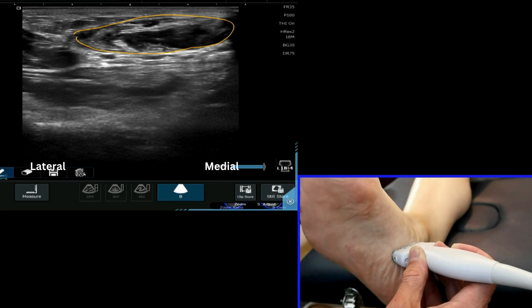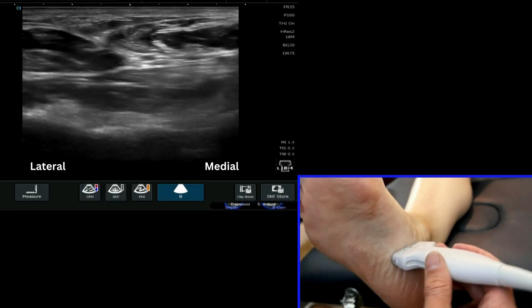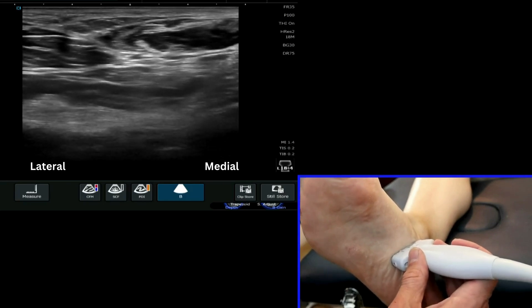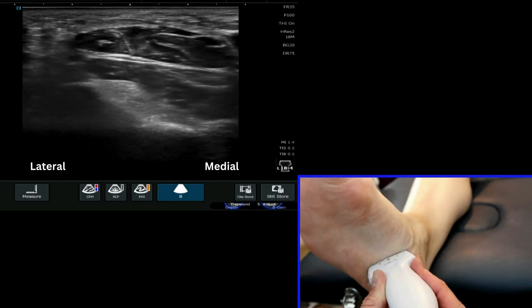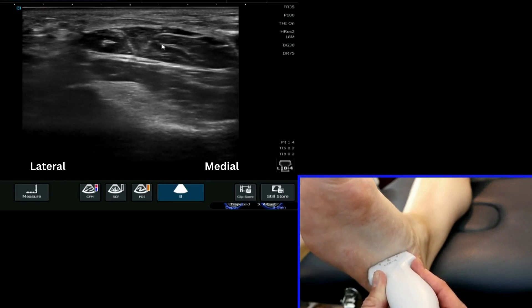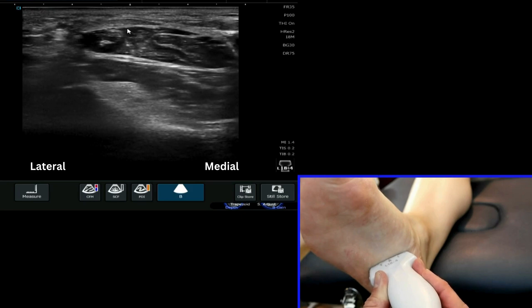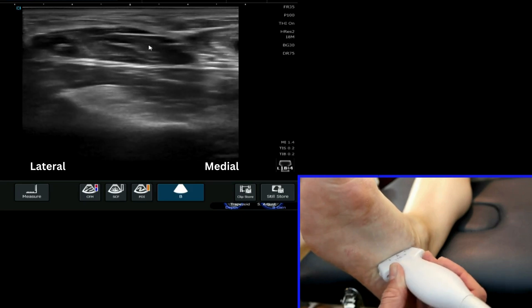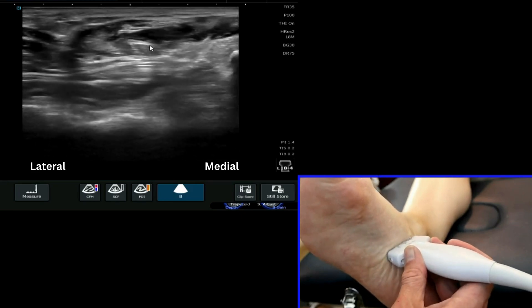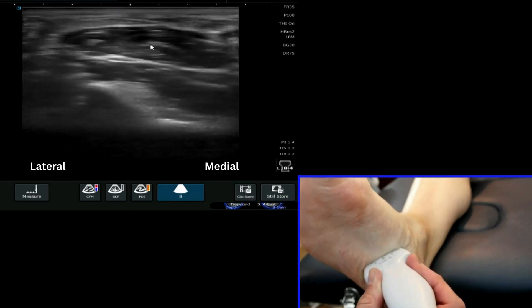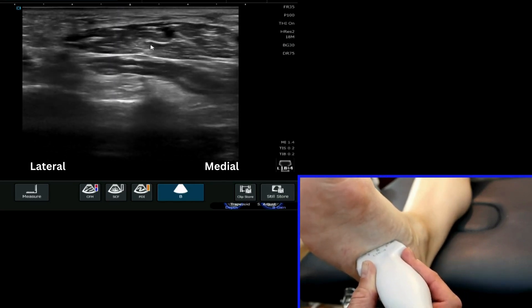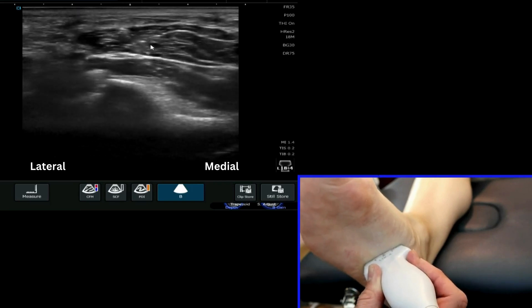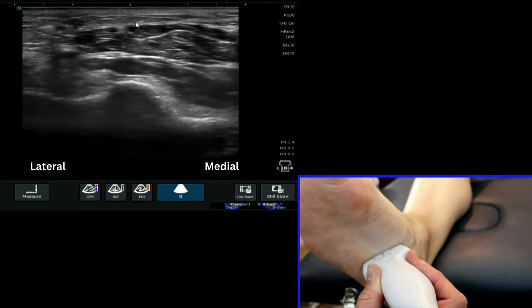And that's your abductor hallucis muscle. You can see with my probe that it actually sits quite a long way medially. As we come back round, we've got FDB again — flexor digitorum brevis — in the middle of the picture, and superficial to it the plantar fascia. So you can see the relationship of these structures together, and it hopefully helps you navigate to the abductor hallucis very nicely and easily by using that familiar landmark of the plantar fascia.